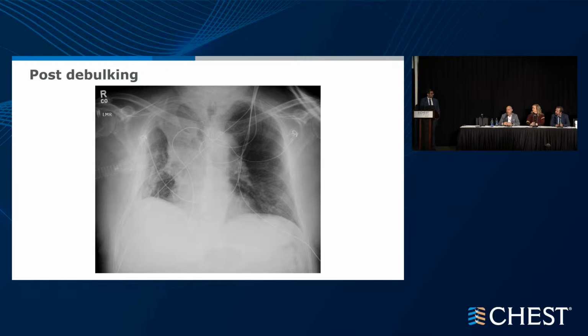I think that upper lobe is gone for a while. So if there was a decision to stent, this would be a right main bronchus to BI stent. Silicone, if you can pass the rigid safely. If not, just a SEMS and start your treatment. We do routine follow-up after any airway intervention, especially if we left a stent.